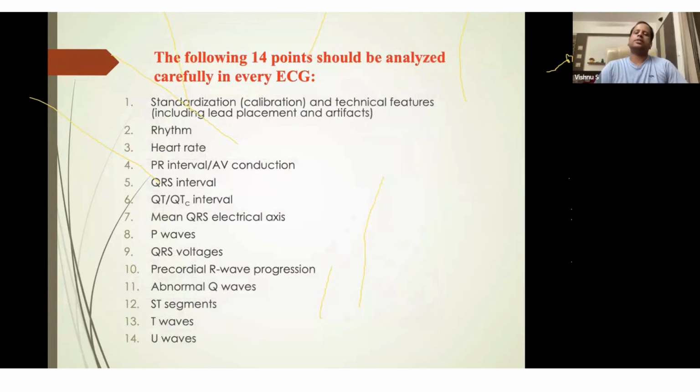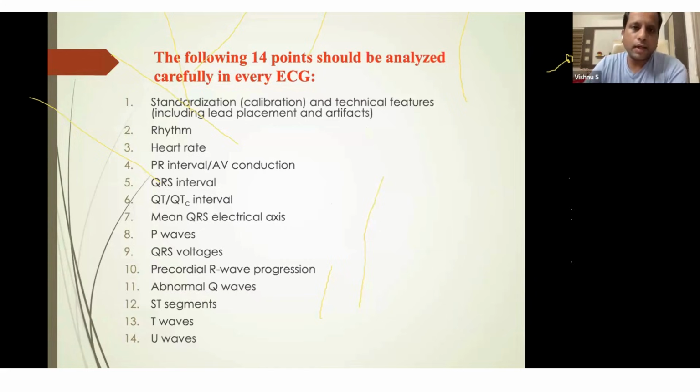ഇപ്പോൾ നമ്മളൊരു ECG സിസ്റ്റമാറ്റിക്കലി അനലൈസ് ചെയ്യുമ്പോൾ ഫസ്റ്റ് ടെക്നിക്കൽ ആസ്പെക്റ്റ് ആണ് നോക്കുന്നത്: ECG എടുത്തത് കറക്റ്റ് ആണോ, ECGയുടെ സ്റ്റാൻഡർഡൈസേഷൻ കറക്റ്റ് ആണോ എന്ന്. സ്റ്റാൻഡർഡൈസേഷൻ എന്ന് പറഞ്ഞാൽ പേപ്പറിന്റെ സ്പീഡ് ഒരു ഫിക്സ്ഡ് ആണ്, വേവ്സിന്റെ ആംപ്ലിറ്റ്യൂഡിന്റെ സ്റ്റാൻഡർഡൈസേഷനും കറക്റ്റ് ആയിരിക്കണം, എങ്കിലേ ഇന്റർപ്രെറ്റേഷൻ കറക്റ്റ് ആയിട്ട് വരികയുള്ളൂ. ഈ ഓർഡറിലായിരിക്കും നമ്മൾ ഓരോന്നും ഡിസ്കസ് ചെയ്ത് പോകുന്നത്. എന്തെങ്കിലും ഡൗട്ട് ഉണ്ടെങ്കിൽ ഇടയ്ക്ക് ചോദിക്കാവുന്നതാണ്.